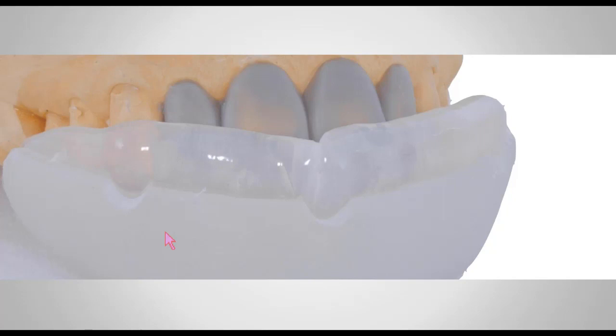I made an impression of my wax up. When you're doing that, you have to eyeball it and make sure that you're centered, so that you have approximately 2 millimeters thickness in the facial, 2 millimeters in the lingual, and 1 to 2 millimeters in the incisal edge. So you eyeball it, but you hold it in place, because this material flows and runs easily.